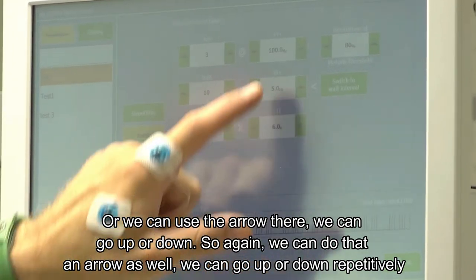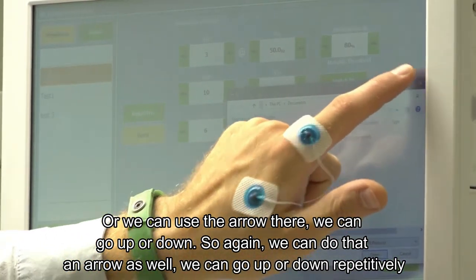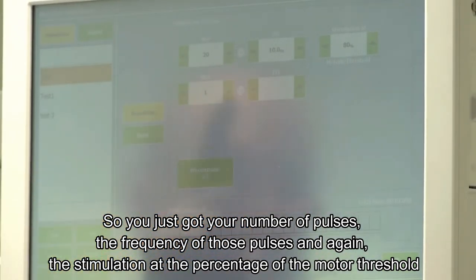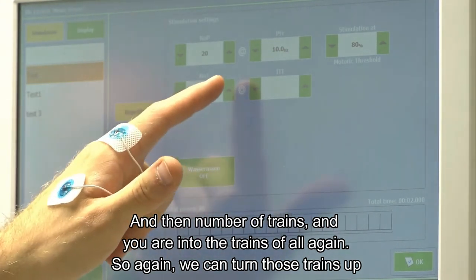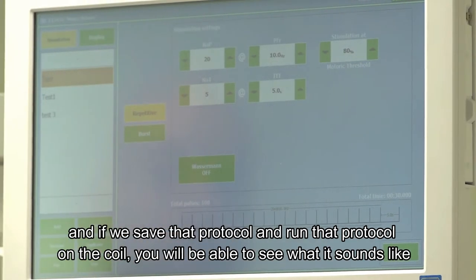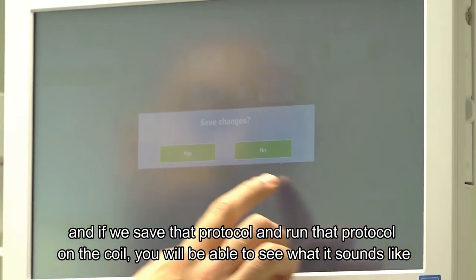If we save that protocol and run it on the coil, you'll be able to hear what it sounds like. Enable the stimulator, then start stimulation either on screen or on the coil itself. That was the protocol we defined just there - really nice and short, but a full rTMS protocol is a little bit longer.